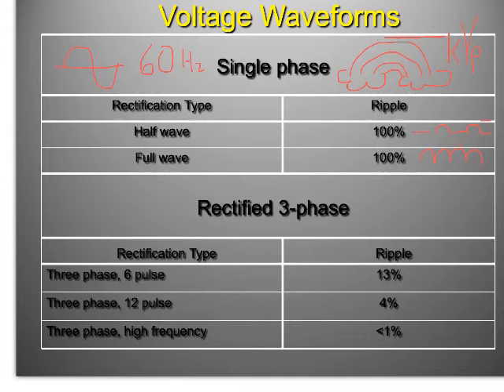Now, it is helpful to know that some of the x-ray machines that we work with are direct current. Your portable machine runs off of batteries. Batteries use DC current, right? So what's interesting is in terms of these considerations, the best pictures that you can get are going to be with the portable machine every time. It is the most efficient x-ray producer, right? So portable is your friend. It's a very, very powerful, very, very useful machine, and it does not have any of these needs for rectification because it's running off of batteries.